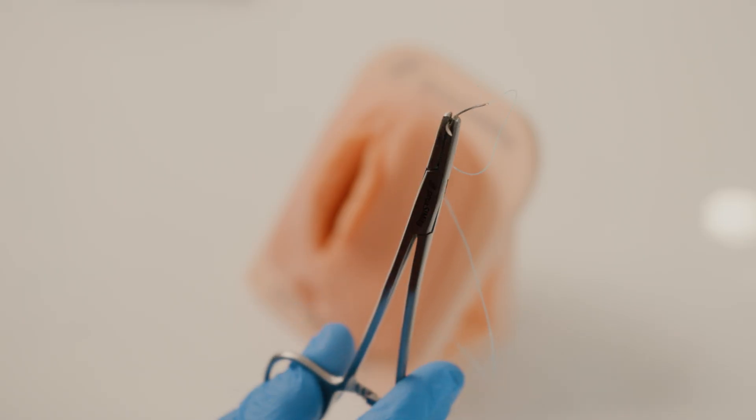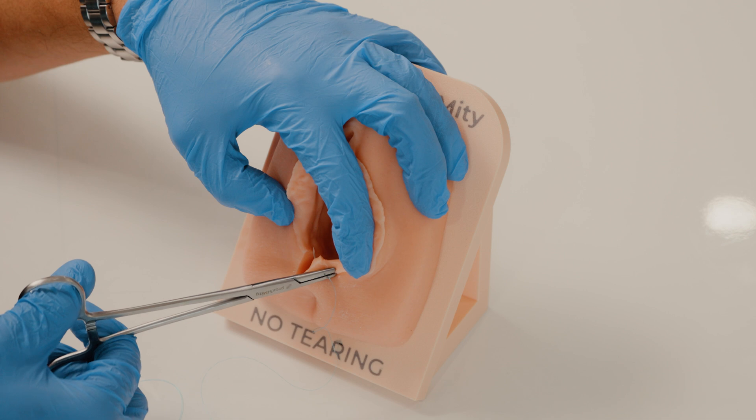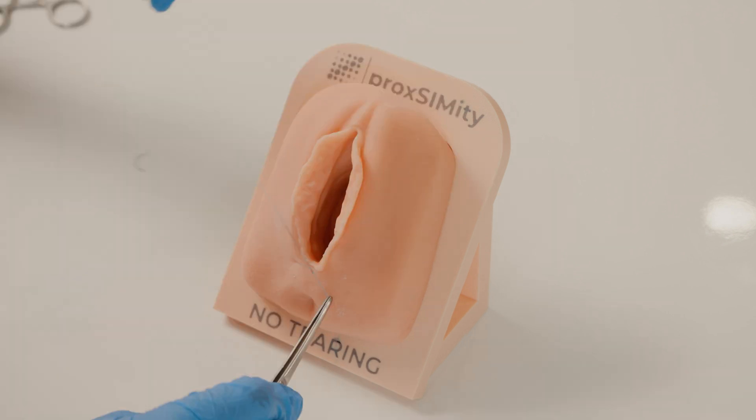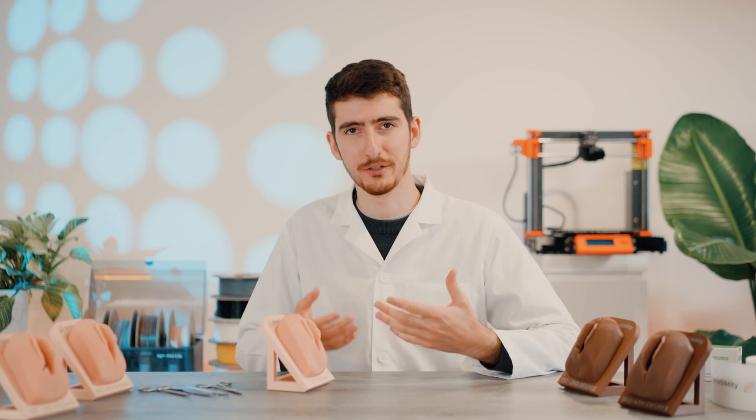Our models are ideal for practicing three-layer repair techniques depending on the size of the tear. We can start the procedure by repairing the vaginal mucosa. After that, you want to repair the muscle layers, which can be done with interrupted or continuous sutures. After that, you can proceed to close up the skin layer. The realistic materials used in this simulator allow you to develop the right feel and muscle memory required for this procedure.